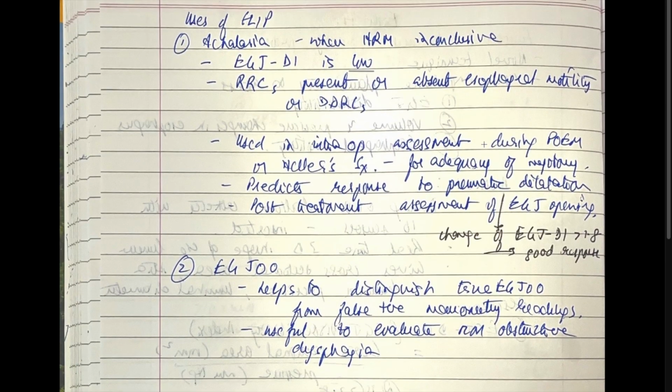The uses of FLIP. In achalasia, when the HRM is inconclusive, EGJ-DI is low. RRCs may be present, or there could be absent esophageal motility, or there could be DDRCs. It is used in intra-op assessment during a POEM procedure or Heller surgery. And you can check the adequacy of myotomy, which places it at a huge advantage compared to an HRM.